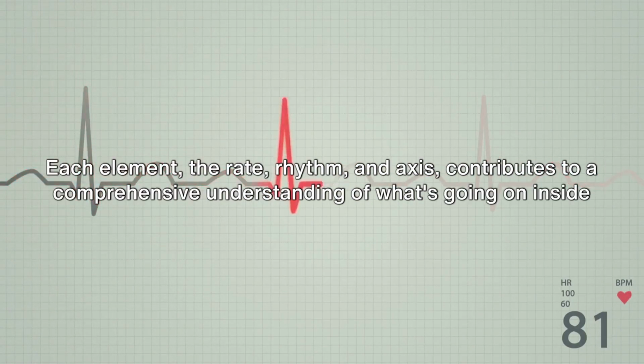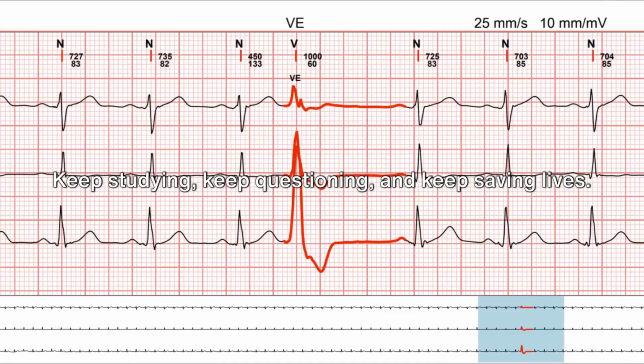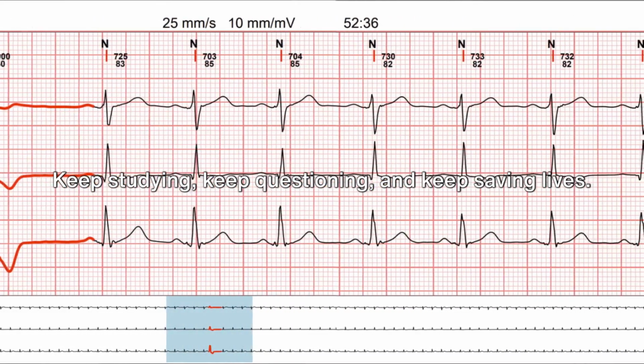Each element, the rate, rhythm, and axis, contributes to a comprehensive understanding of what's going on inside the heart. Remember, mastering ECGs takes practice. Keep studying, keep questioning, and keep saving lives.